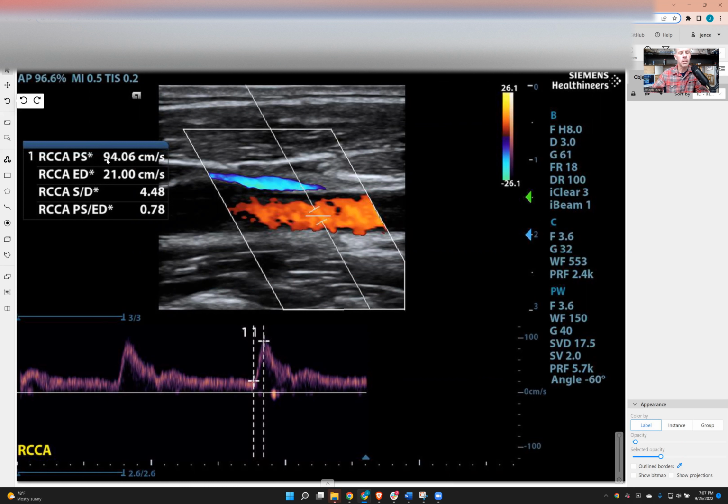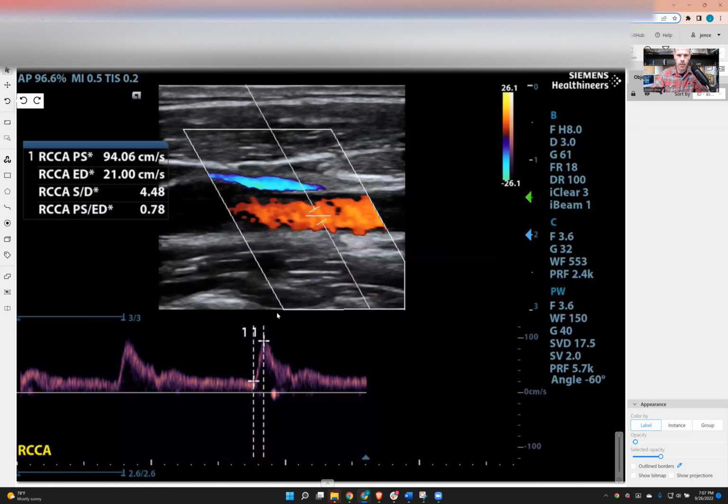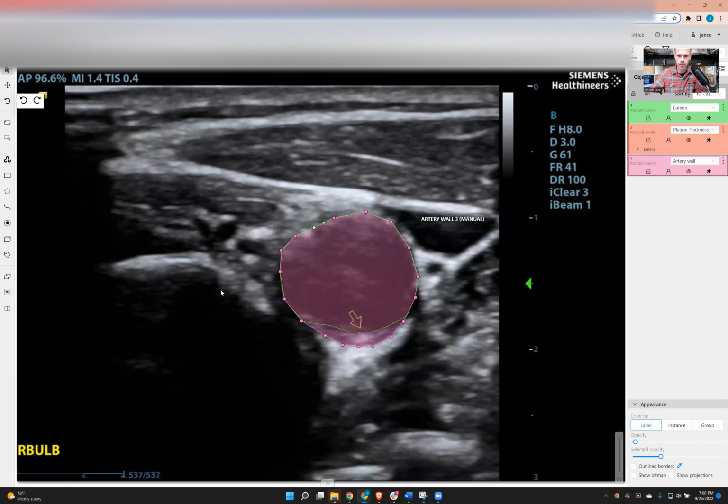Anything less than 150 is fine. 125 is fine. This on my own artery is an atherosclerosis beginning to grow. That is a plaque. This is it from the top down. This is it from the side. And let's see, here's a top-down view of that inflammation.